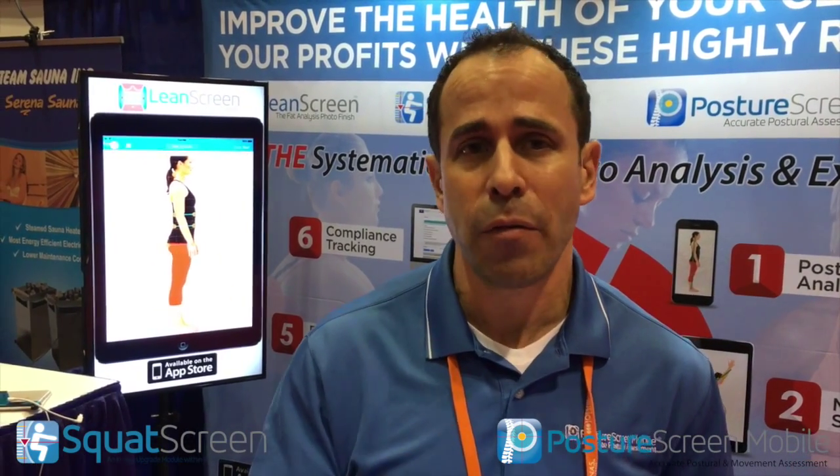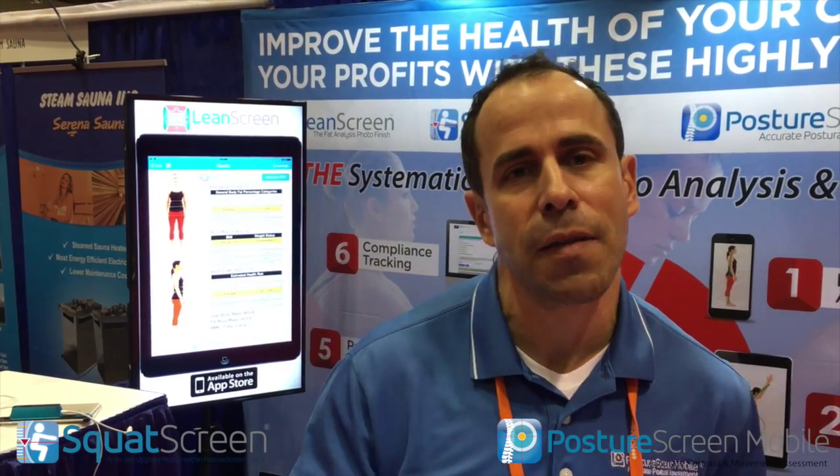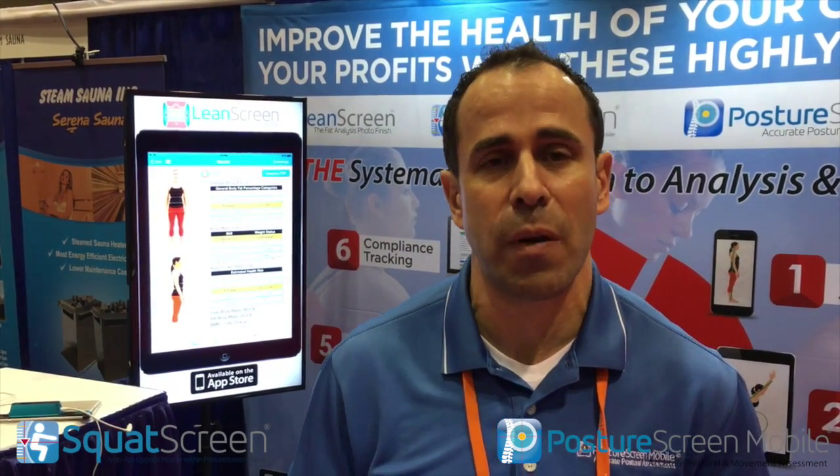Yeah, you heard right. Within Posture Screen Mobile is a new movement assessment module called Squat Screen. We have Plank Screen, Push-Up Screen, and many others in the pipeline. What's truly unique is we're not just videoing anything — we're truly digitizing and getting real measurements from the client. And best yet, we're able to link those dysfunctions automatically to narrow down the scope of exercise prescriptions.